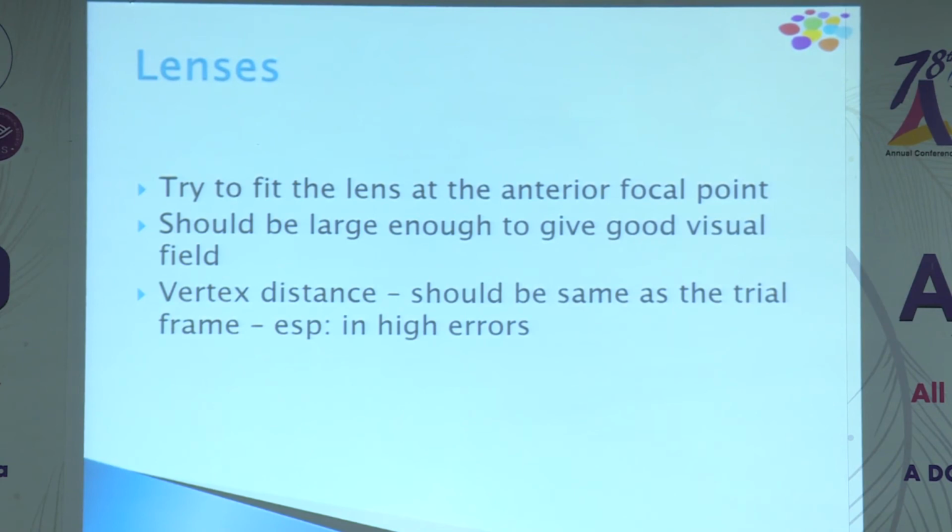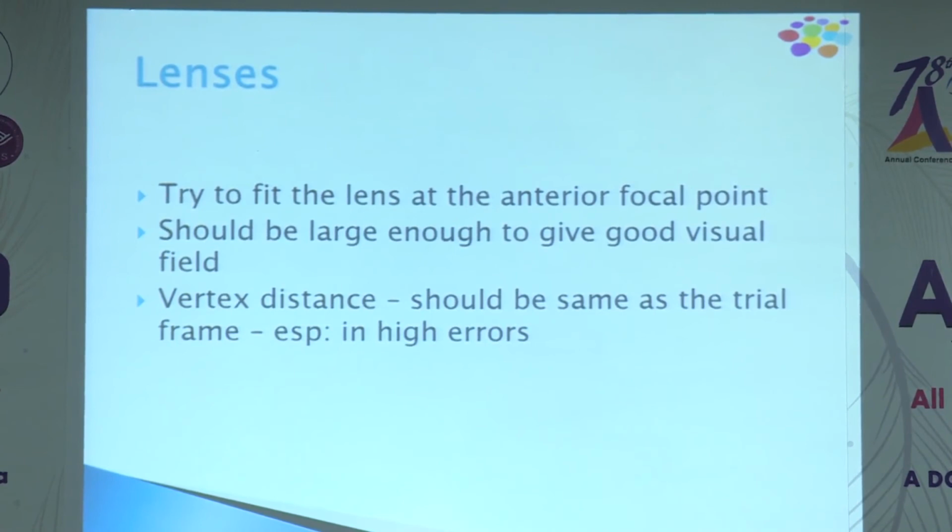Sometimes your trial lenses or trial frame will be totally different, some curved trial frame. Once I found that one refractionist was doing the whole thing every day, the patient kept coming back, and we were searching and telling the refractionist to do it properly. Finally, we found that the trial frame was bent. So these small things sometimes create a lot of problems.